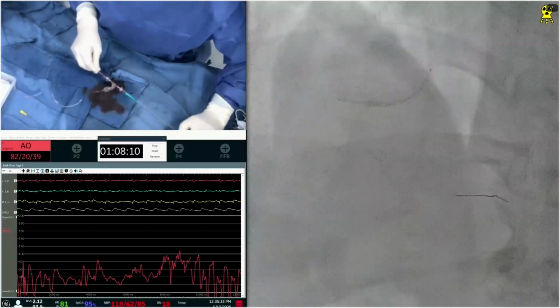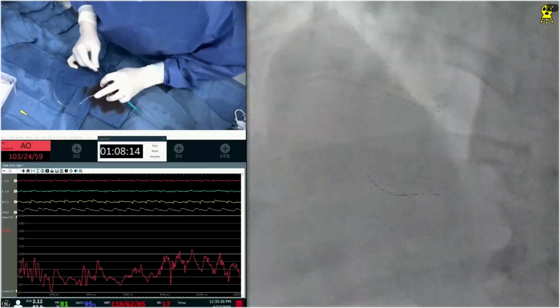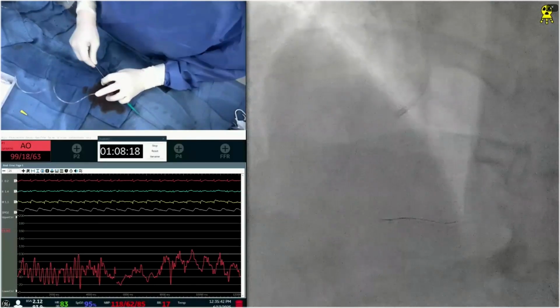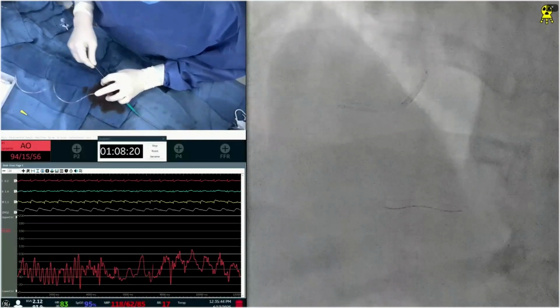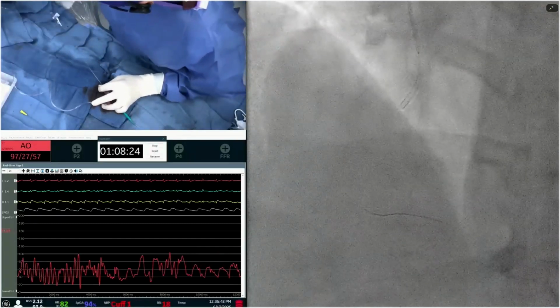Here comes the stent. Pretty long stent, this is the stent now, Dr. Sharma. Yeah, we thought that we'll use a long stent, but it may not make the turn despite a good balloon dilatation. Get a Fielder wire. Let's see. So the question comes down, what do you want to do?